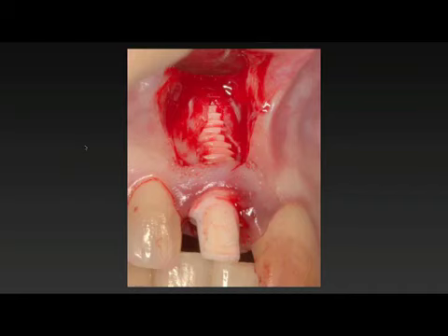So we are a little bit of the pioneers in this, and we want to see what the advantages and disadvantages are. This would not be a disadvantage of the implant. This would be just the selection of a wrong implant in the hands of the surgeon. A CeraRoot 21 would have been a much better choice here, but this gentleman had large teeth, and the surgeon, myself, thought a larger implant would be beneficial here.